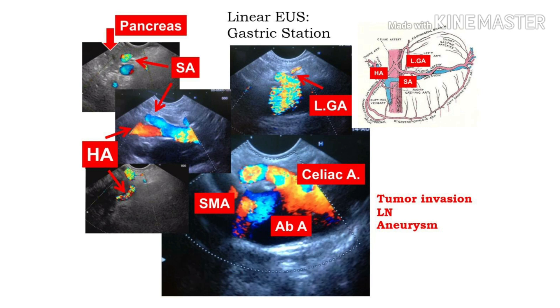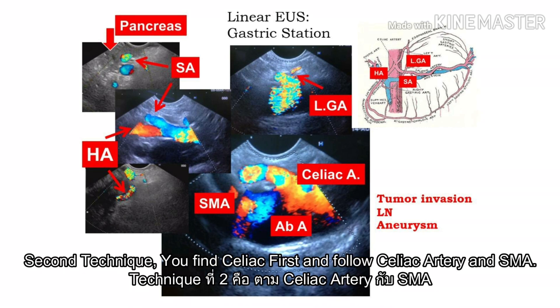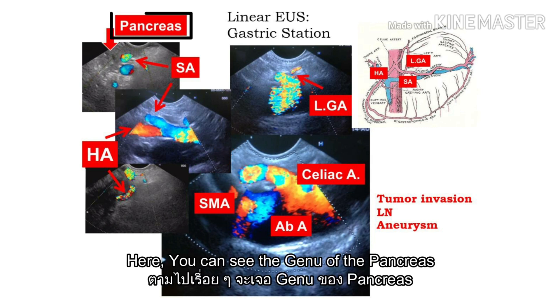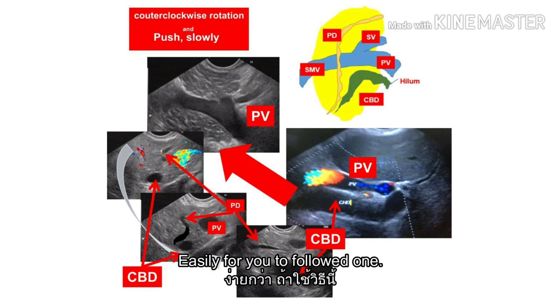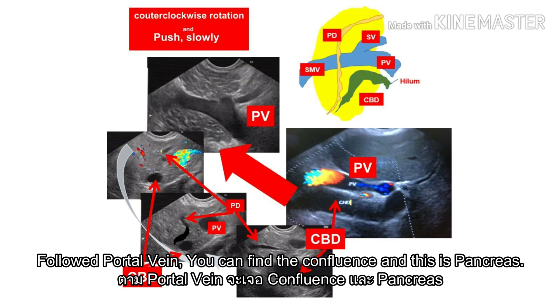The second technique — mostly found in textbooks: find the celiac first, and follow the celiac artery and SMA. Just advance and follow these two vessels to find the genu of the pancreas. But my recommendation is that following the portal vein might be better — it is easier to follow. Follow the portal vein, you can find the confluence, and then the pancreas.